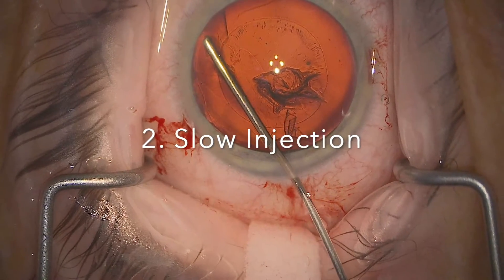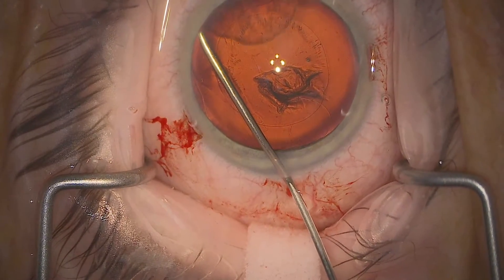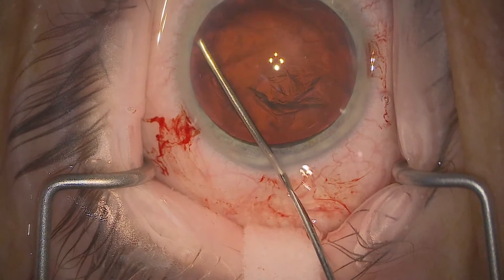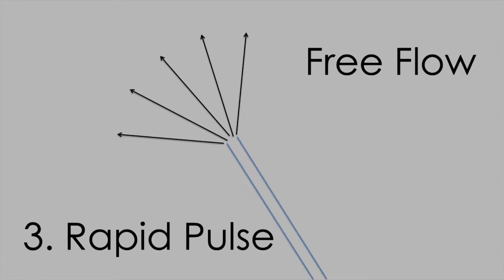So slow injection once you've defined your plane. A good sign you've got free flow is when the anterior capsule pops out and you're ready to pulse around the back. Now let's pause for a moment to consider why free flow is so important to the rapid pulse phase of hydrodissection.